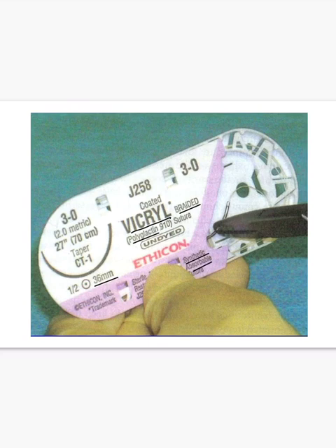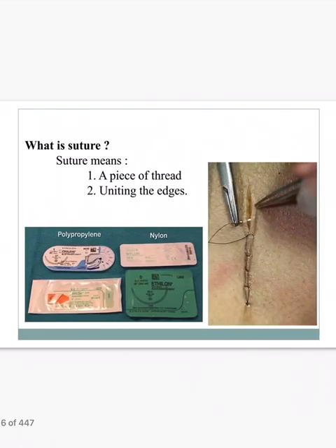But when you answer these questions, the teachers or professors are even smarter than you. Then they will ask you to give some examples of other multifilament sutures. They'll ask you, if this is synthetic absorbable, what is natural absorbable? So you need to know about the suture material, and this is also important from your MCQ aspect. So let's get started with the suture material.